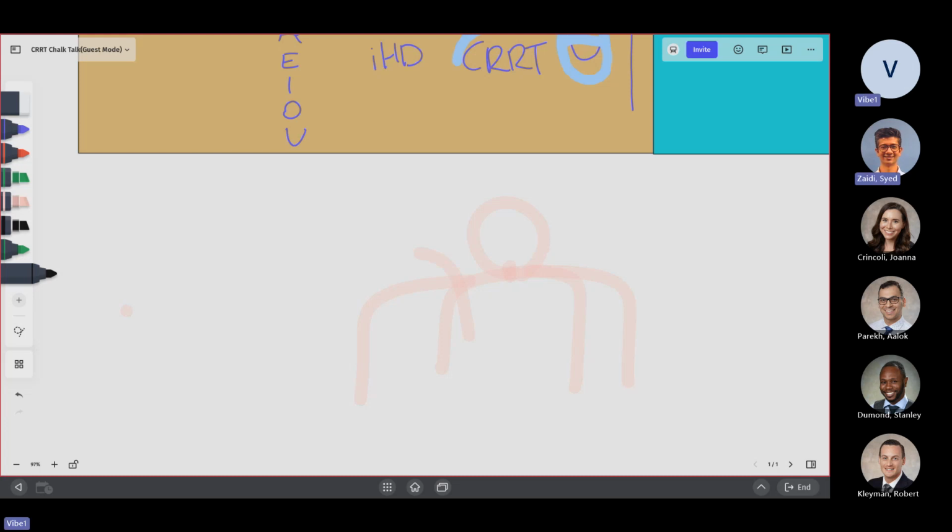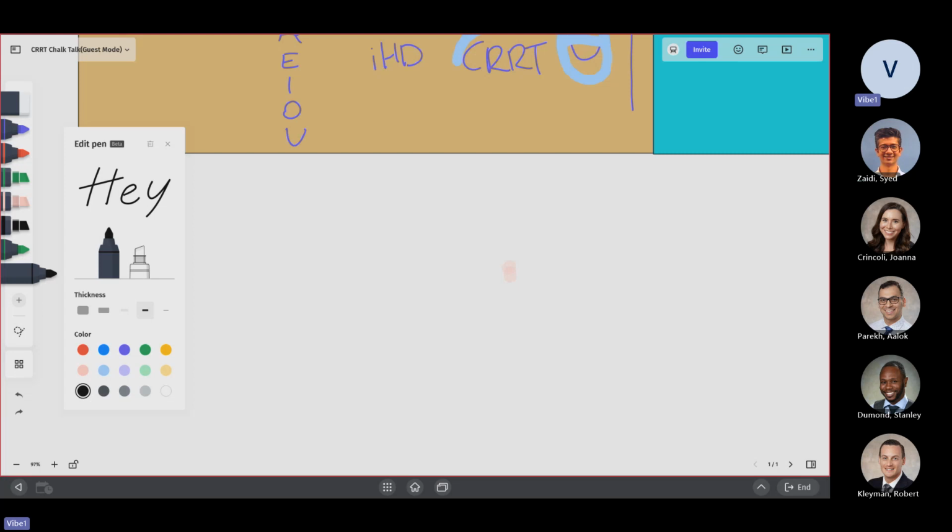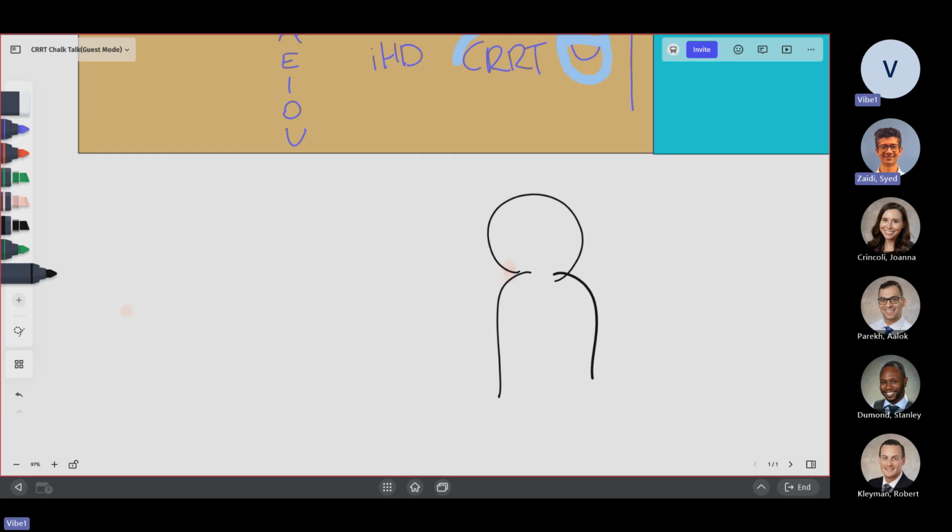All right, let me start that over. So at some point you have your patient, and you're going to get an access line in.